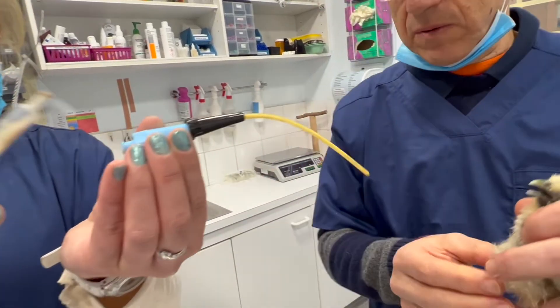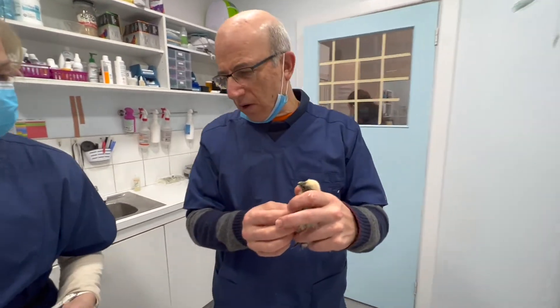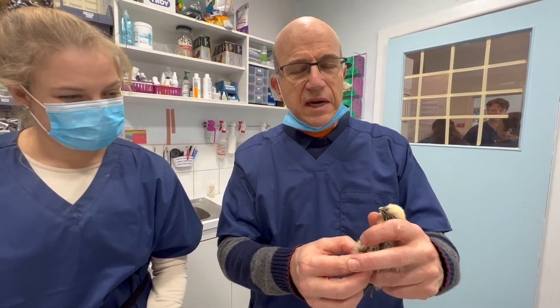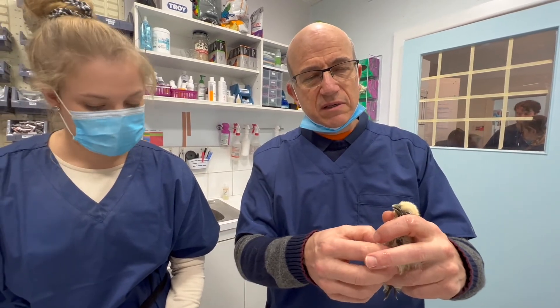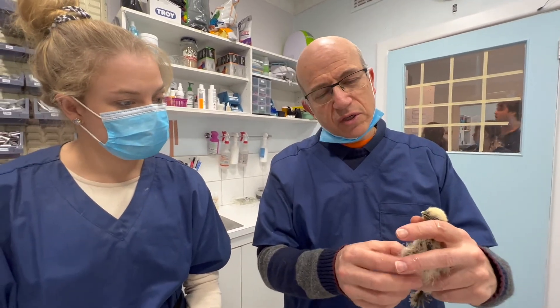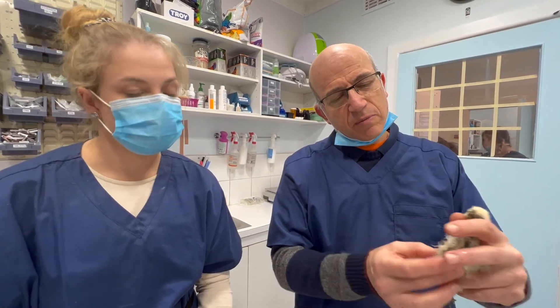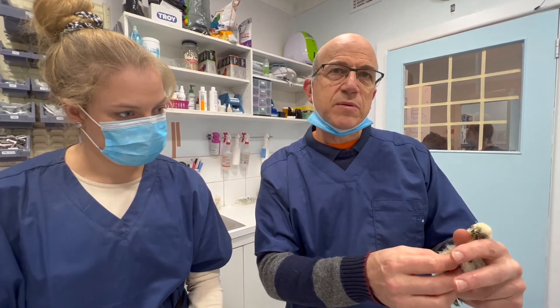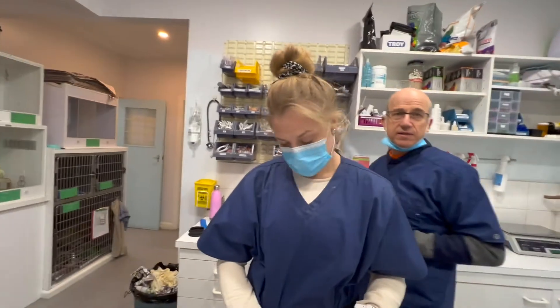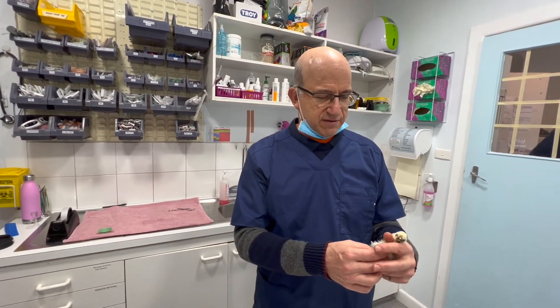Okay, let's just take it out and see how we're going. We've taken up quite a lot now. I can feel sensing here — we've taken up quite a lot of stuff. We've washed and flushed, washed and flushed, so we feel happy. Now I can actually feel the crop for the first time, and it doesn't feel like there's a foreign body — I can feel some seed in it. Should we be going in surgically? I can't see a reason. I'm going to go in surgically tomorrow if I need to. But for right now, the crop is as empty as it's going to be. So now we're going to start antibiotics, anti-inflammatory, cisapride, and some poly-Aid. Could you draw for me three mils of poly-Aid, please? We can get to see all the stuff we took out — we actually took out a fortune. There's quite a few mils there.